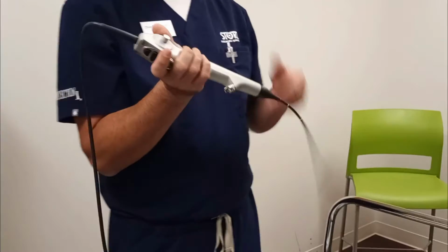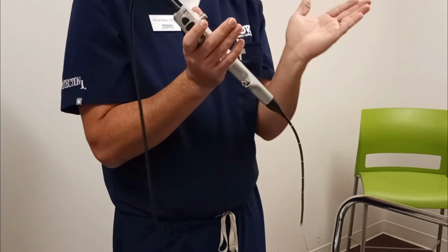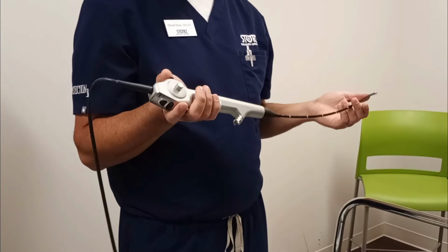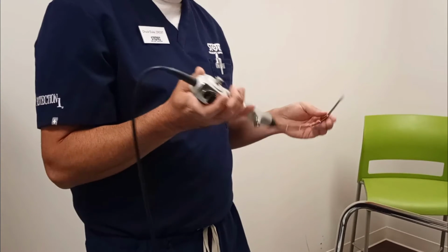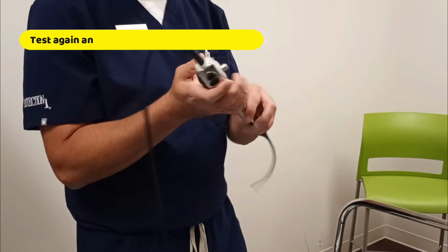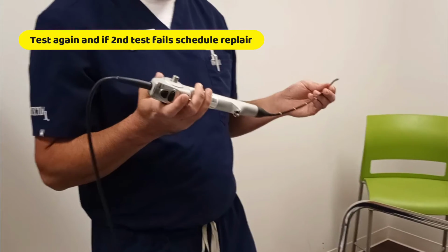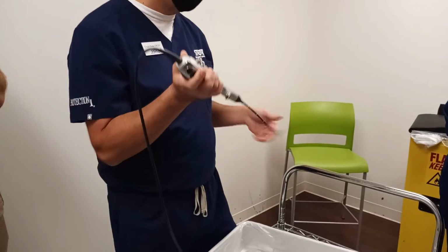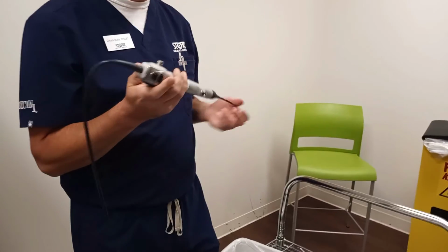Then what's going to happen is on the leak tester, you're going to see a drop, right? Everyone's familiar with the drop. At that point, it's a failed leak test, and hopefully that's not the case. If it does fail the leak test, whatever your protocol is here for a failed leak test, that's the way we're going to take it. Let's just say it passes. So it passes. We're going to decrease the pressure down to 180.